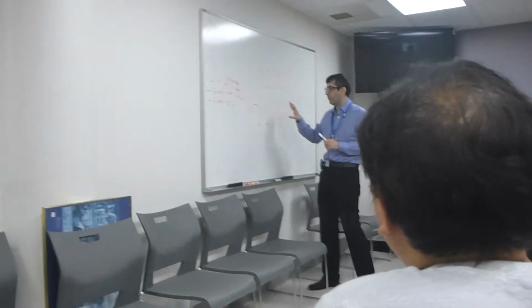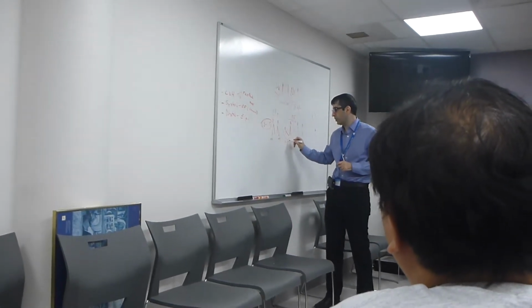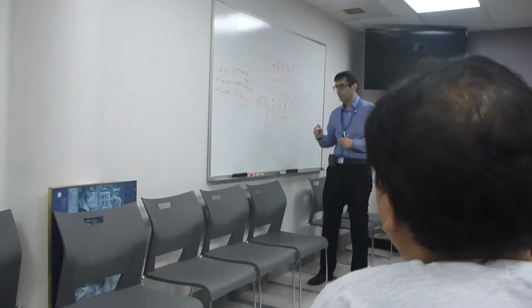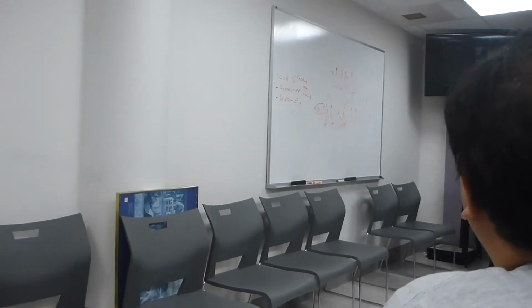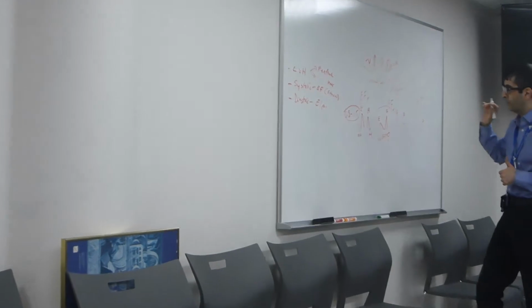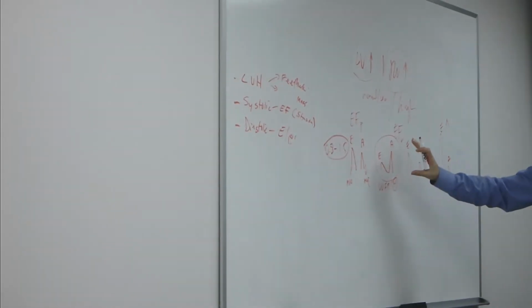much more than normal people with the kind of headroom. The good news is that when you have this type of pattern, usually your LV filling pressures are normal. So this is very important to understand. If you have a relaxation filling pattern, your LV filling pressures are typically normal or low.